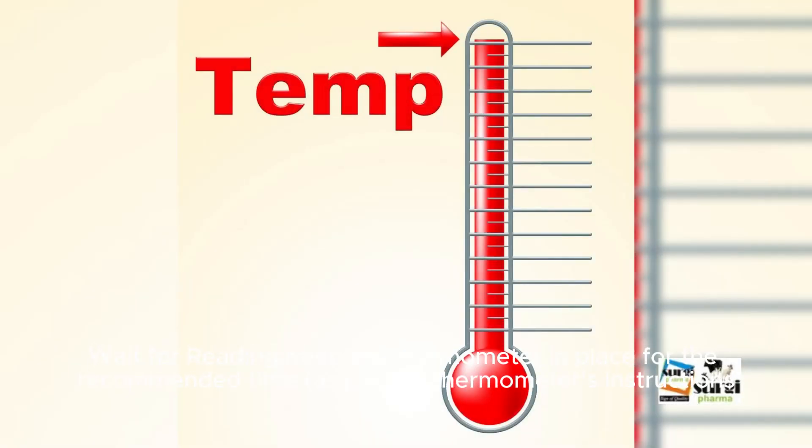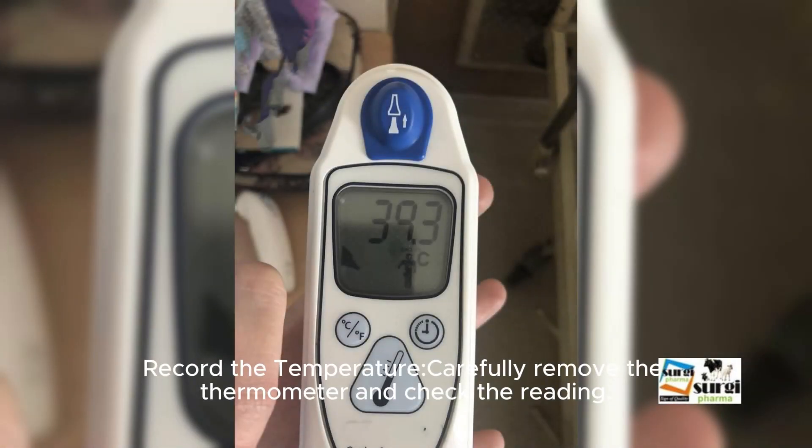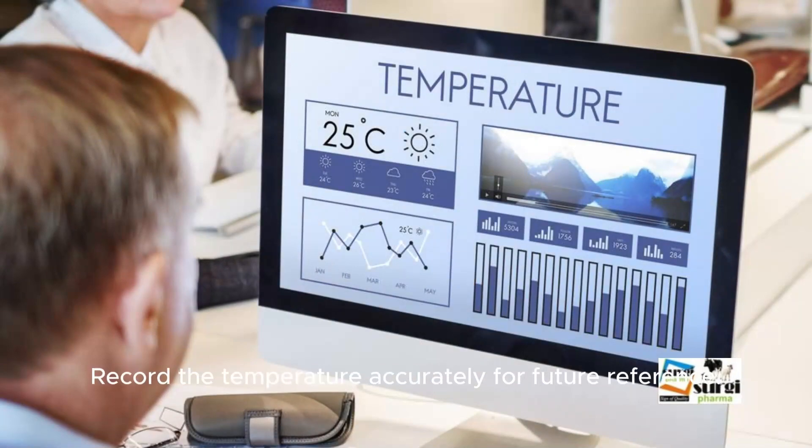Wait for the reading. Keep the thermometer in place for the recommended time as per the thermometer's instructions, until it beeps or signals completion. Carefully remove the thermometer and check the reading. Record the temperature accurately for future reference.